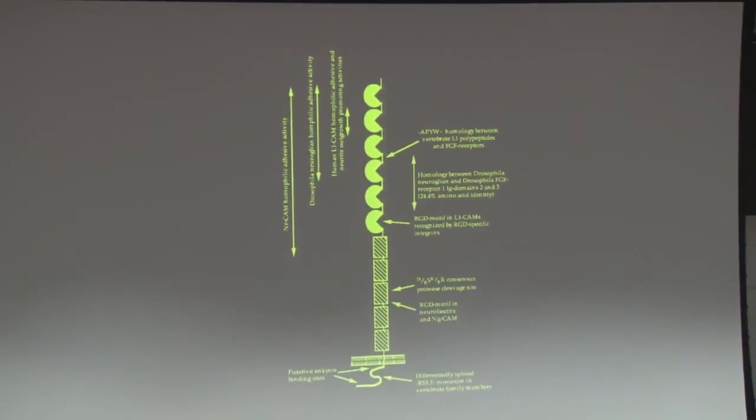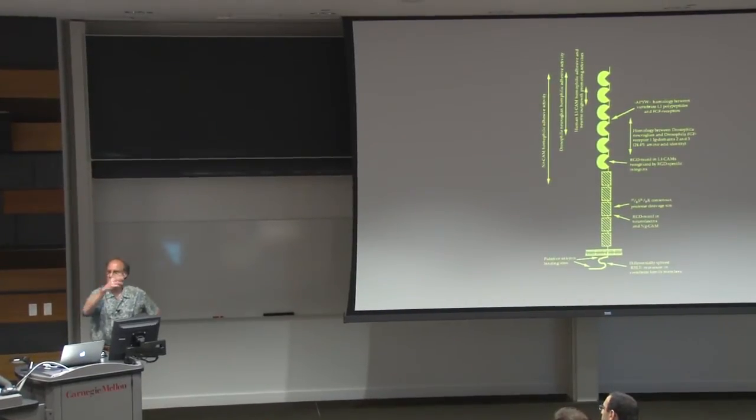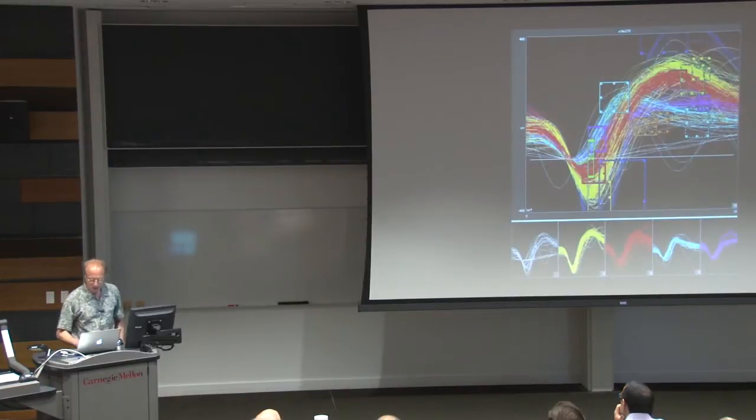There's a number of technologies that are being developed. One thing that we've done, actually, I can show you, we're putting bioactive molecules, attaching them to the electrode. There's one molecule we're using, called L1. It's an adhesion molecule that's naturally there. So it sort of guides growing neurons to their targets. And so what we've done is we put this on our electrodes, and when you inject these in, sprouting naturally occurs from axons all around it. And it actually looks like they're attaching to the electrode. And that gives us these incredible recordings.